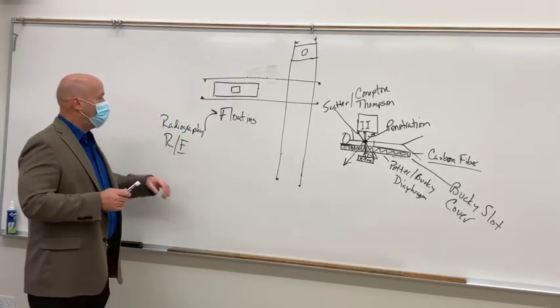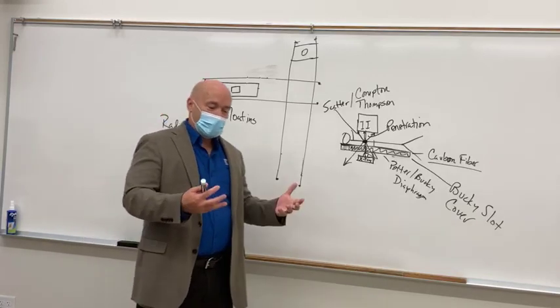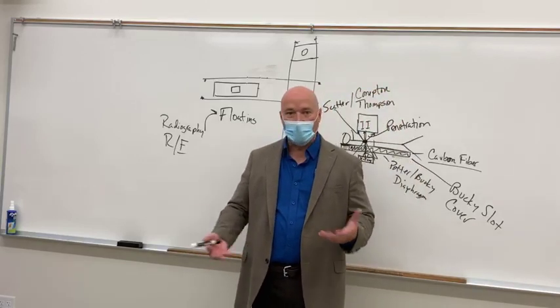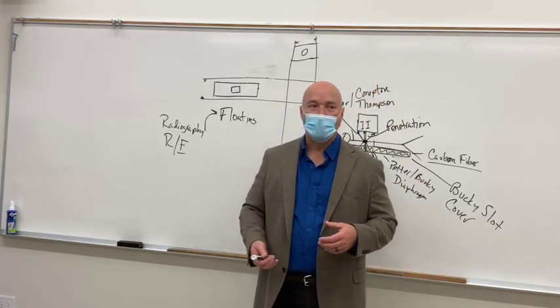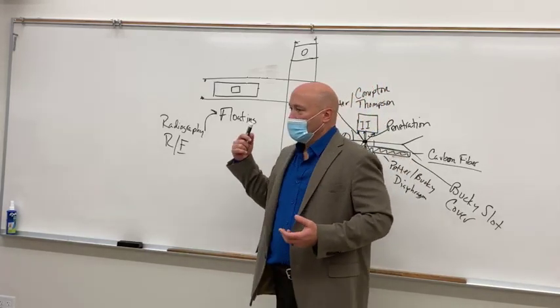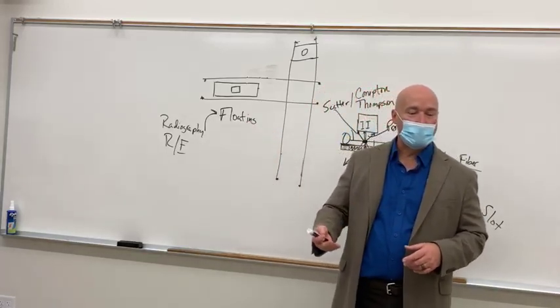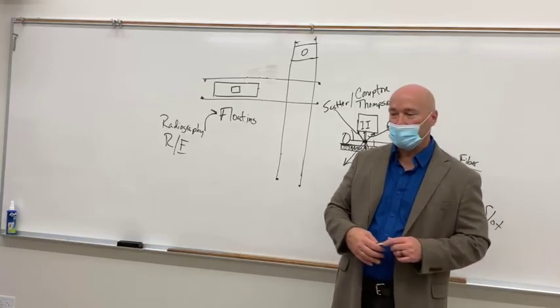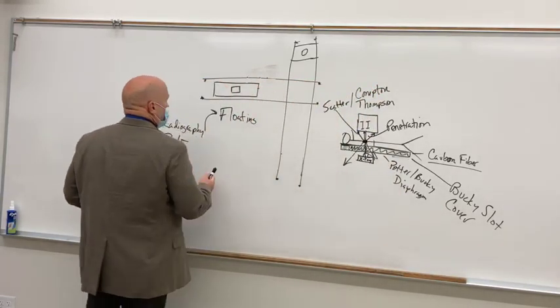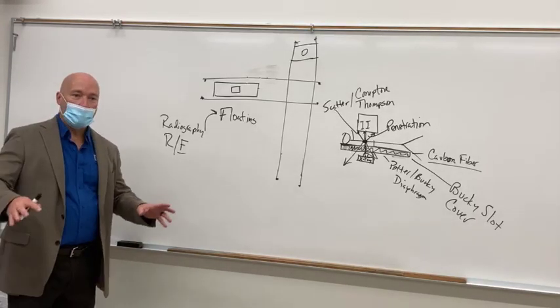But if we had these floating tabletops in fluoro rooms, and the footboard was on good anyway, and the patient stepped on it, and they weighed enough between the footboard, the table, and their own body weight to move that floating tabletop, again, you're back to the patient might fall down and fall into the unit and hurt themselves, okay? You don't want that. So the benefit of a floating tabletop is ease of movement. You step on that pedal and you can drag it anywhere you want to very quickly.